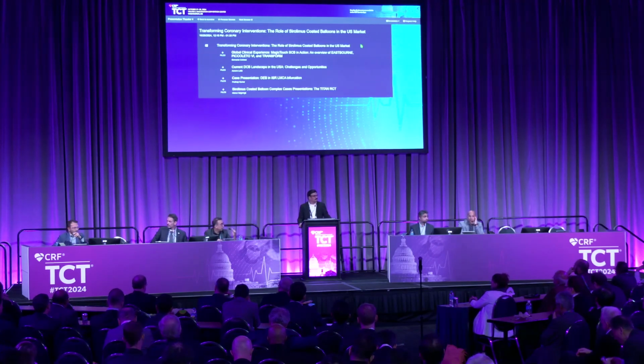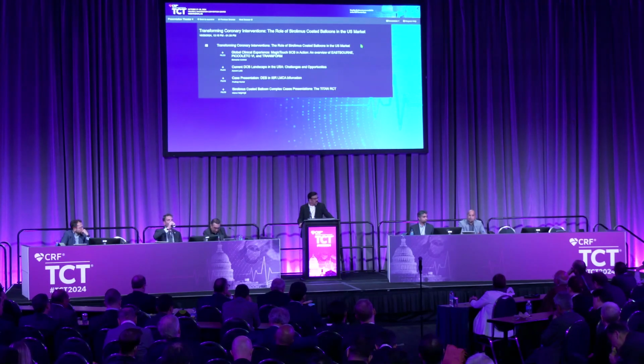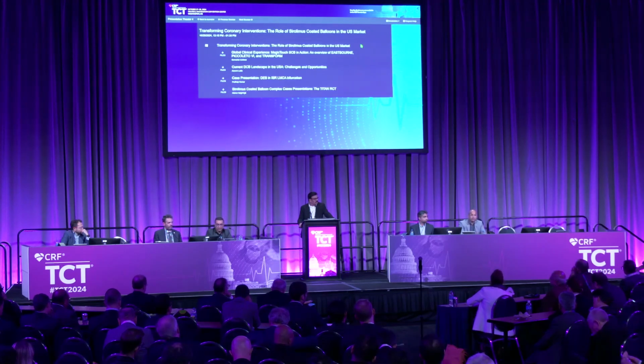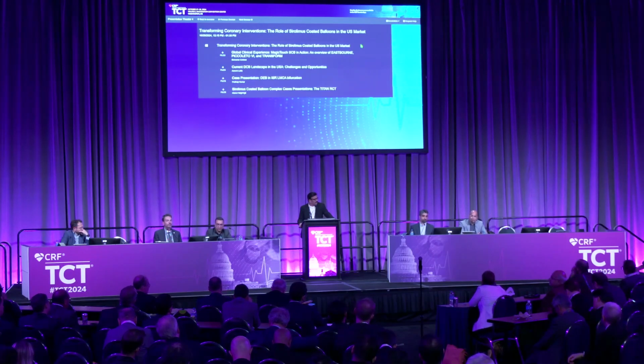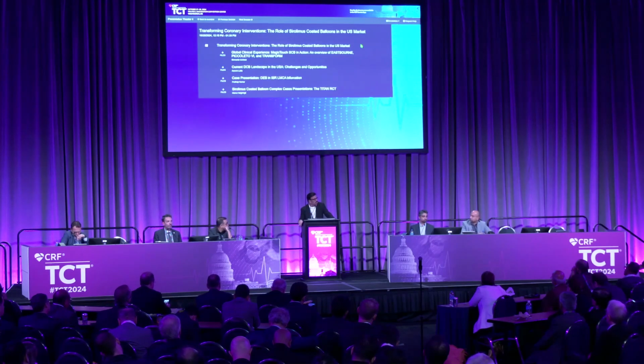It's also important because it's very hard to expect a balloon that is an anti-proliferative delivery vehicle to prevent restenosis when the reason the stent had restenosed is because it was underexpanded. And oftentimes you may think angiographically it looks fine, but if it's underexpanded, you need to expand it first before expecting the drug to do its thing. So from my sense, that was a reason that it's essential to figure this out. Even if you don't care about understanding if it's neoatherosclerosis or whatever, just know that the expansion is as good as you could possibly get, like the cases you showed, before then proceeding.